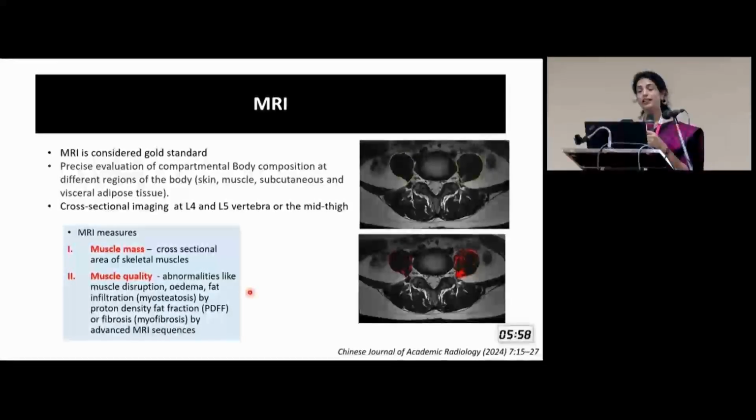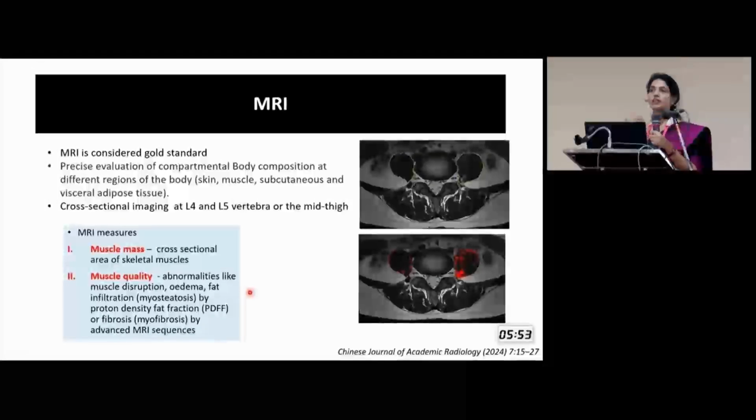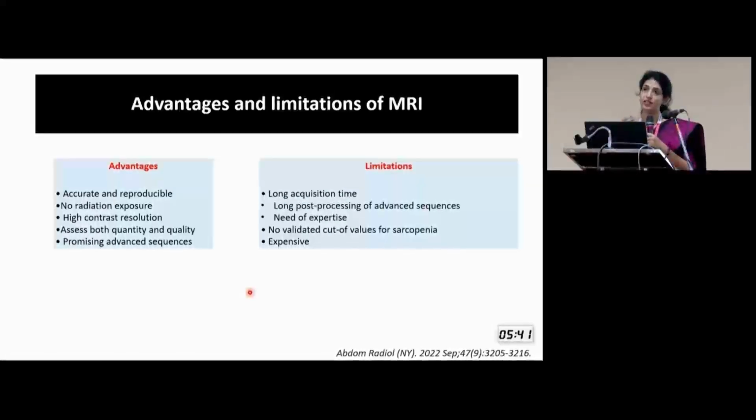Most importantly, intramuscular fat, IMF, is now being proposed as an important risk factor for cardiometabolic diseases, and this evaluation is very useful for that. It cannot be used as a screening tool in clinical practice. It's mostly for research-based smaller studies to understand muscle quality and quantity because of limitations like the complicated procedure, the need for expertise, and the cost.